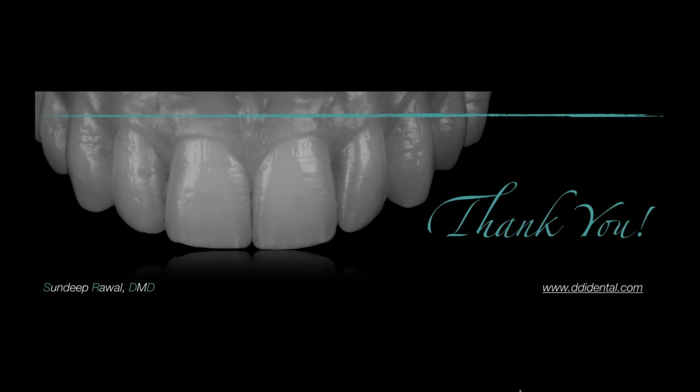And so you get what we call haptic feedback that stops you from moving. So it's a physical limiting step, the same as static-based resin guides, with the ability to be dynamic and change the plan intraoperatively, similar to camera-based navigation. I hope that answers that question. It's a little bit of a long discussion, but that's a brief synopsis of what robotics and implant placement means today.